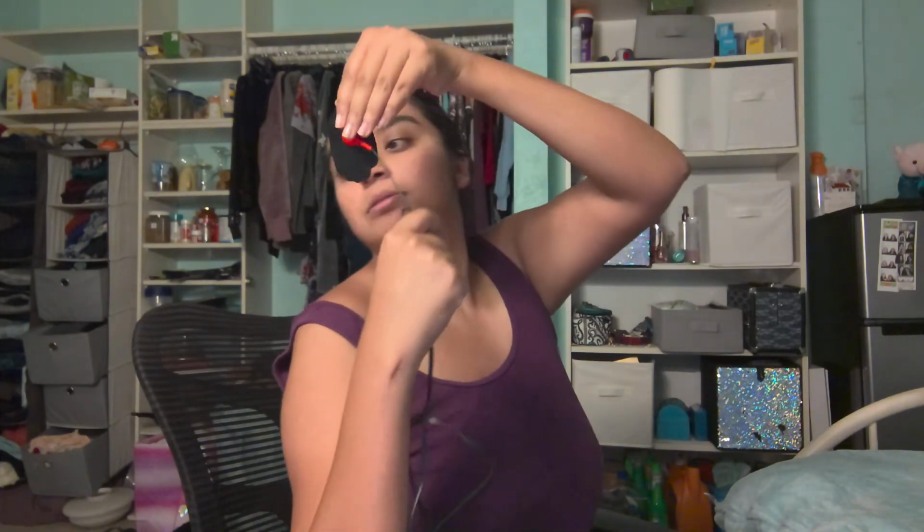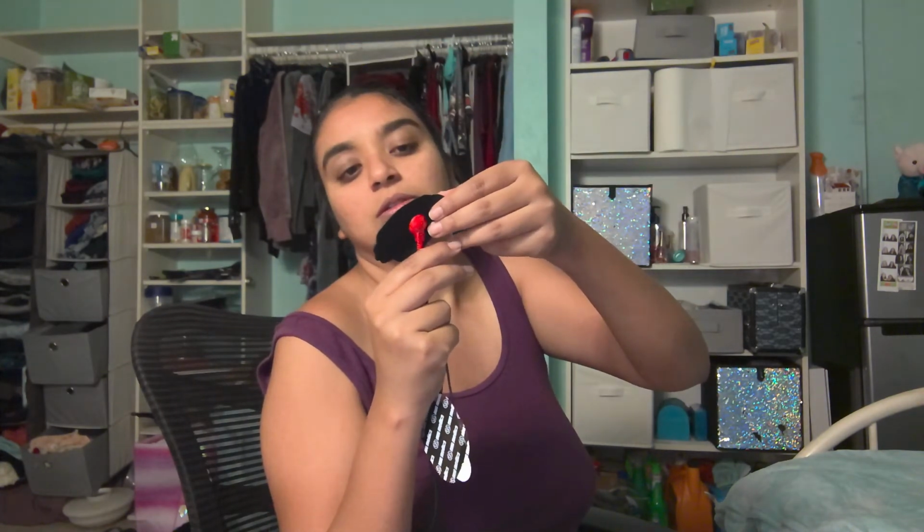And you're supposed to have a clean area. I just showered, so nice and clean. It has to be a little damp, so done and done. We're going to unstick that. Ooh. Super sticky, as it should be. Let's see if I can put this on properly. Usually you would put the padding and then you unstick it or connect it or whatever. That's what we do on my dad's, but it's usually a two-person job. Not on my shirt.